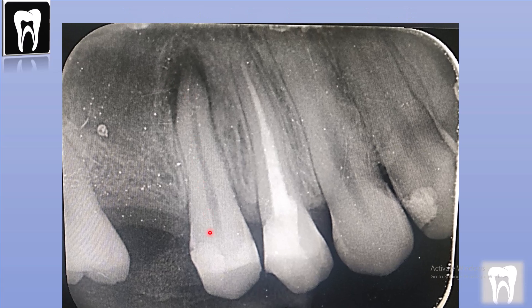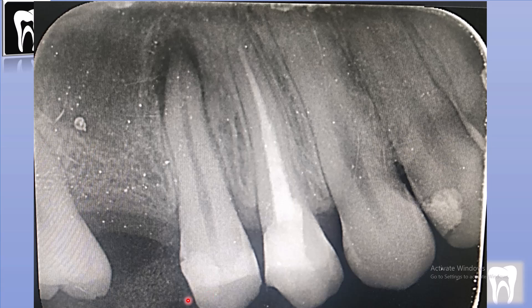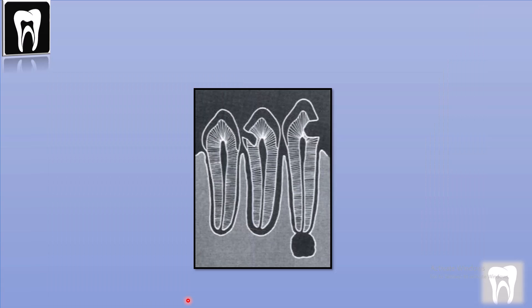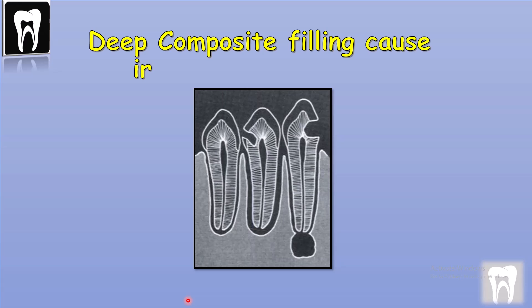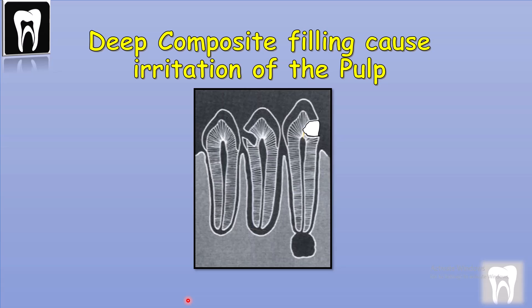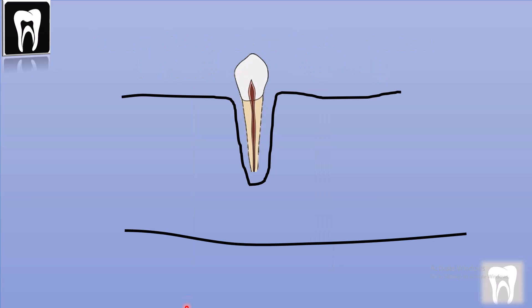If you look closer, you can see this deep composite filling. Composite filling can cause tooth necrosis, especially when the filling is so close to the tooth pulp. So the leftover microorganisms and the irritation of the filling start an inflammatory process. The inflammatory products are acidic and they resorb the periapical bone.